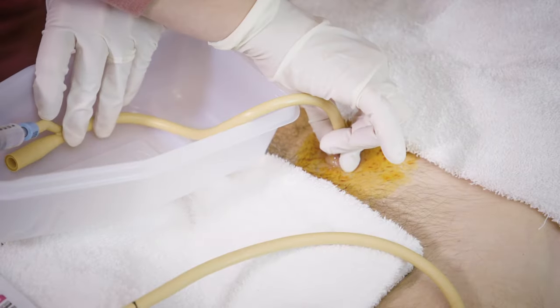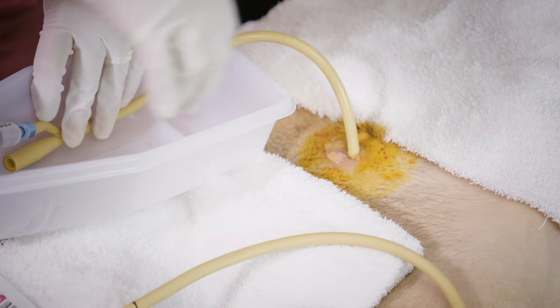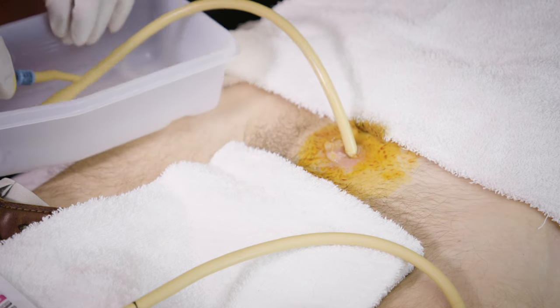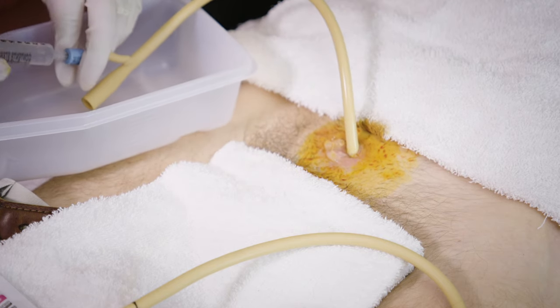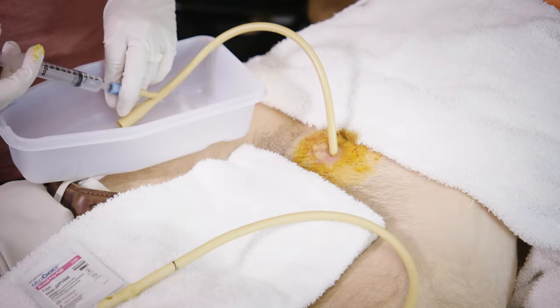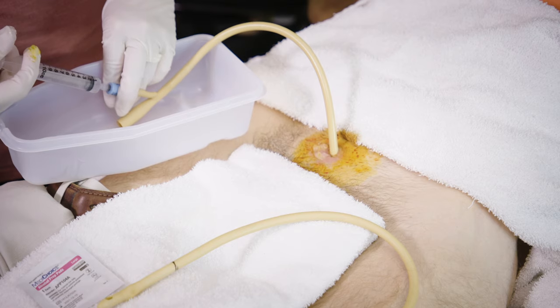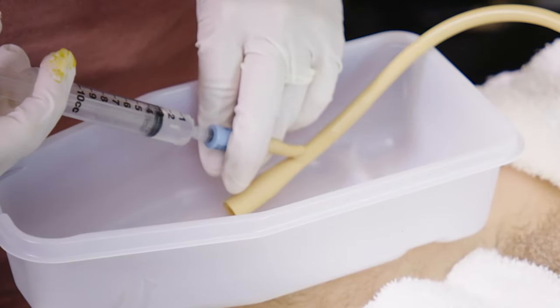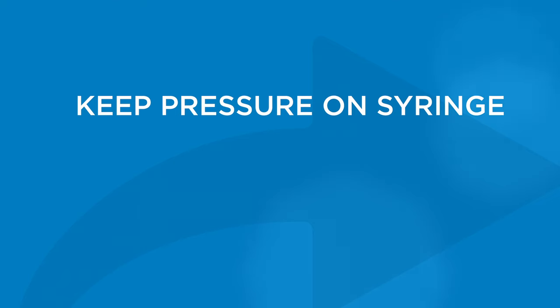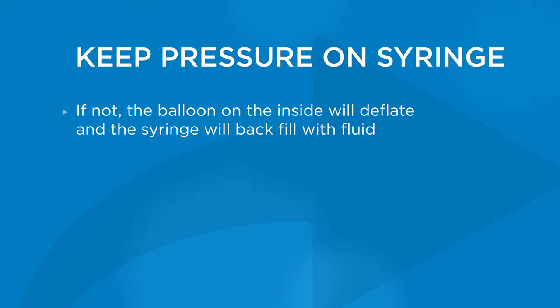Ideally, you'll want to see urine drip out of the catheter tubing before you inflate the balloon, but this may not always happen. Next, inflate the balloon. To do this, hold the colored port with one hand while injecting the fluid of the filled syringe into the catheter. Keep pressure on the plunger of the syringe while you twist and remove the syringe from the port. It's important to keep pressure on the syringe while doing this, because if you don't, the balloon on the inside will deflate and the syringe will begin to backfill with fluid.